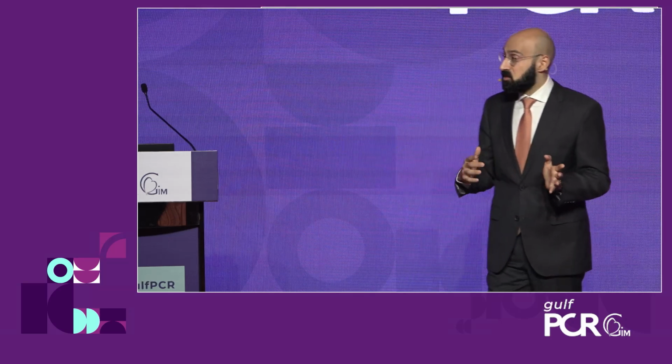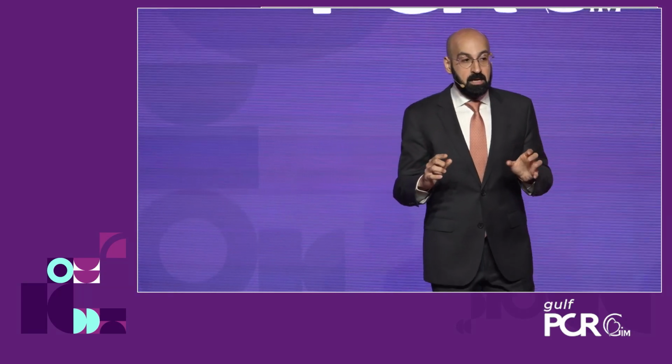And I think what we learned from this trial is that it's very important to look at two views before you decide if the valve is fully expanded or not. This is one of the criteria that was added, and I think Rasha will discuss that. It's not only important to have a low gradient and low paravalvular leak, but also a good expansion. Yes.